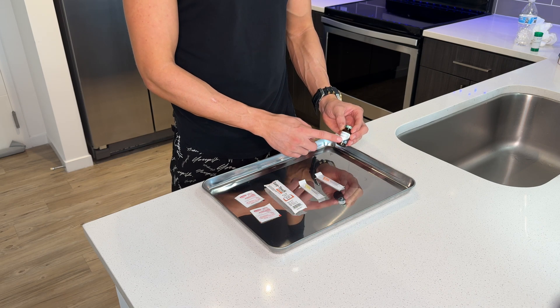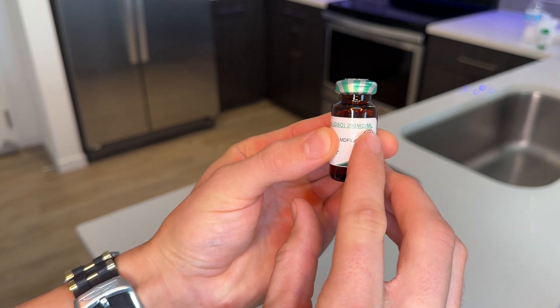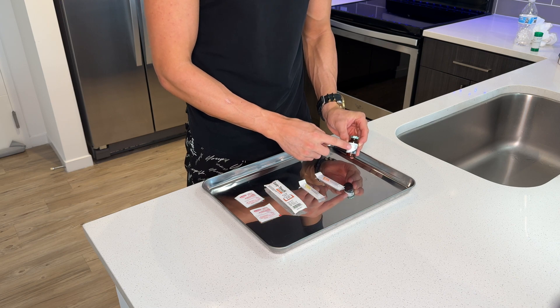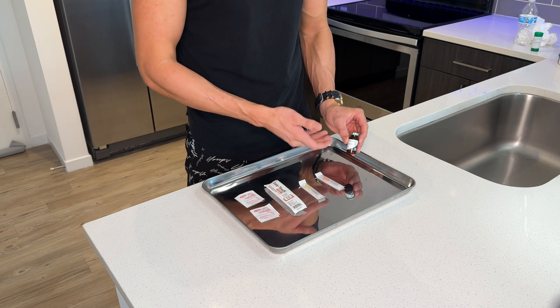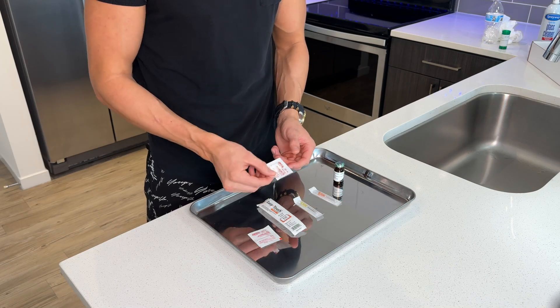Now it's important to know the milligram per milliliter on your testosterone. Most testosterone vials are 200 milligrams per milliliter. And what that means is if you were to pull back a full milliliter or cc of testosterone, you're gonna have 200 milligrams inside that cc or milliliter. For example purposes, today we're gonna be preparing a 100 milligram shot. The first thing we need to do is sterilize the vial with a prep pad.